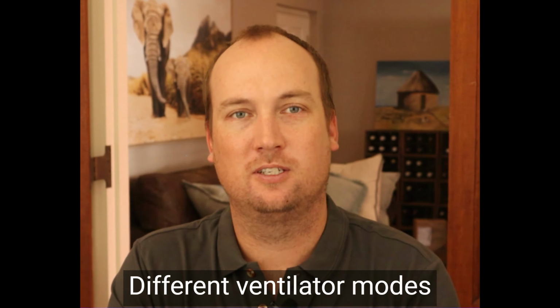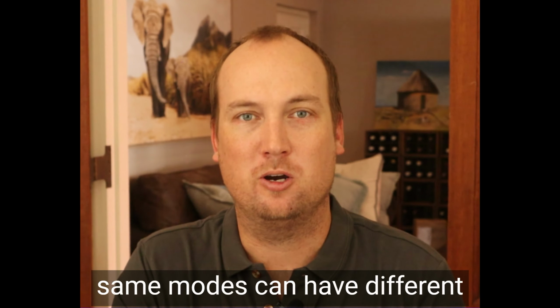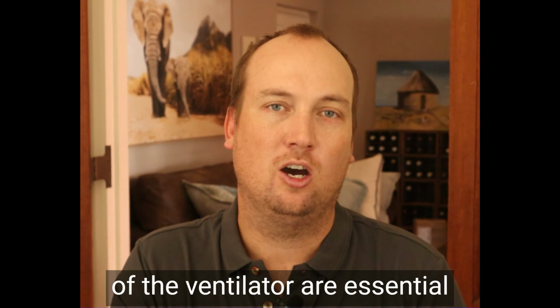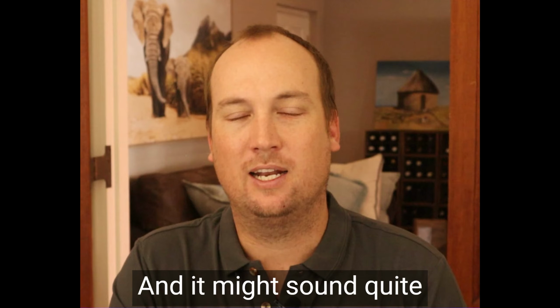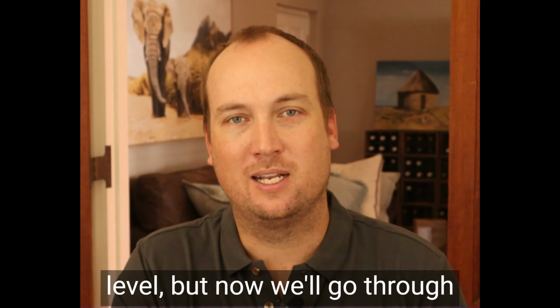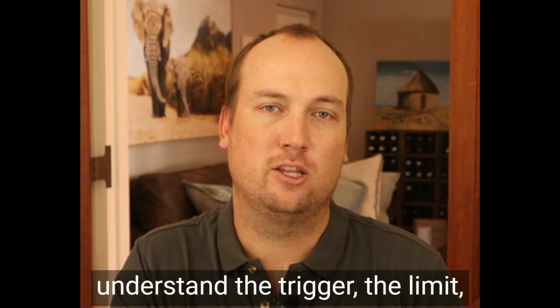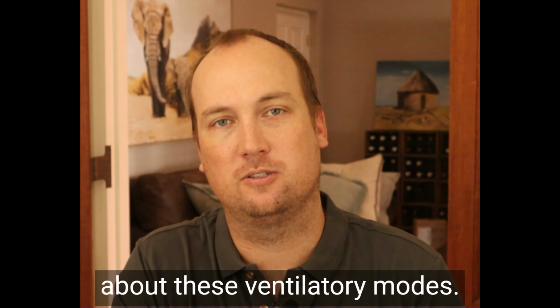Different ventilator modes, and sometimes even different ventilator makes displaying the same modes, can have different triggers, limits, and cycles. Understanding these aspects of the ventilator is essential for understanding more complex modes of ventilation, and it might sound quite intimidating at this learning level. But now we'll go through the more common, simpler modes of ventilation, and you'll realize how easy it is to understand the trigger, the limit, and the cycle when thinking about these ventilatory modes.